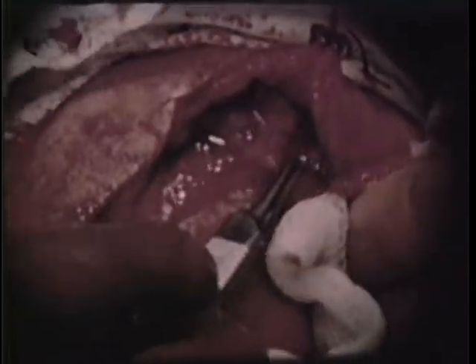First, the stellate scar is removed. Removal of the scar and dissection of the underlying tissue exposes the bone ends. To establish the size and contour of the graft, a pattern is prepared. Rongeurs are used to freshen up the ends of the mandible and provide a better surface for the attachment of the graft. The end surfaces of bone are evened off to provide maximum contact and good blood supply.